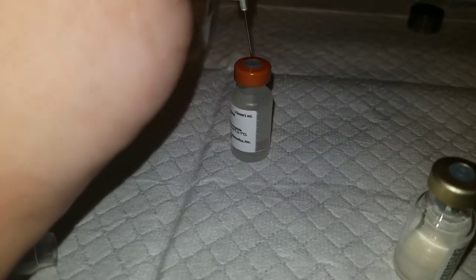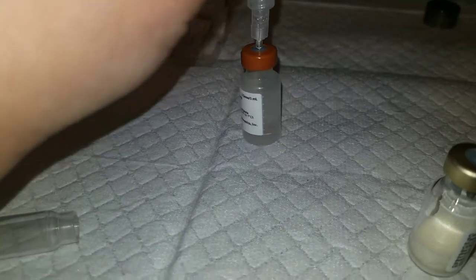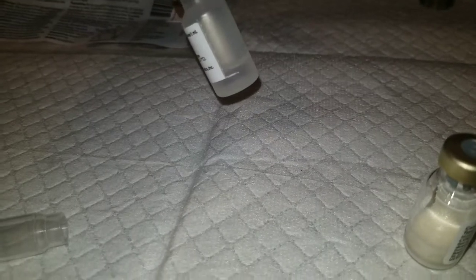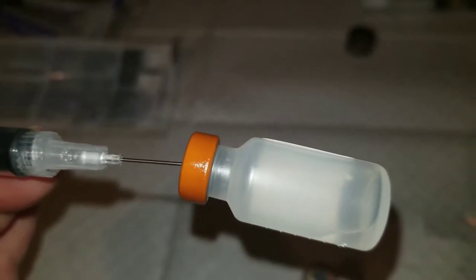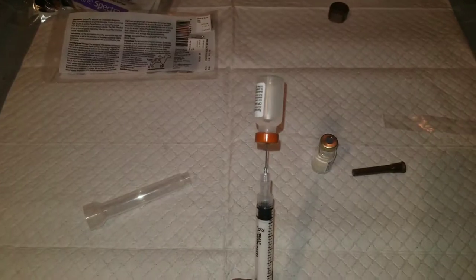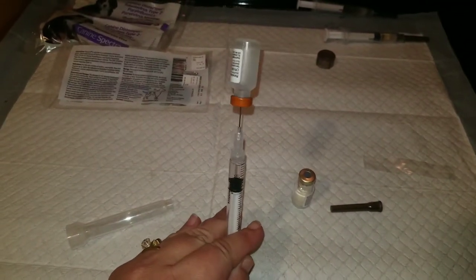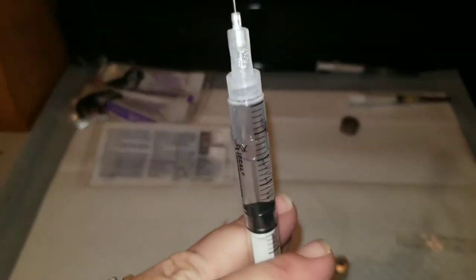Place the needle into the liquid vaccine. Then you push the air into the vial. Line up your needle so that it's flush with the gray rubber stopper, turn it upside down, and release your thumb. The air you pushed in will actually fill the plunger with the liquid.